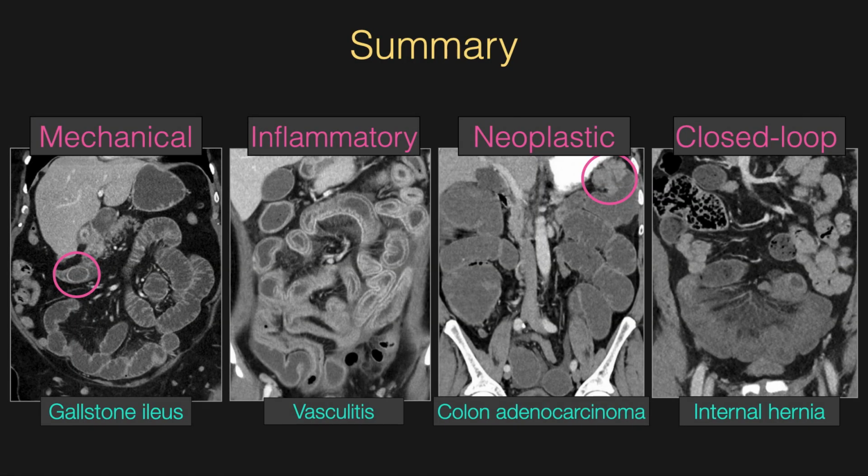In summary, we have discussed several important causes of complex small bowel obstruction or obstruction-like conditions, including mechanical causes, inflammatory causes, neoplastic causes, and closed loop obstruction.